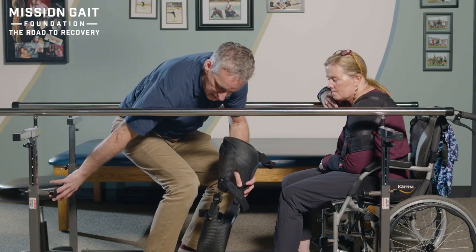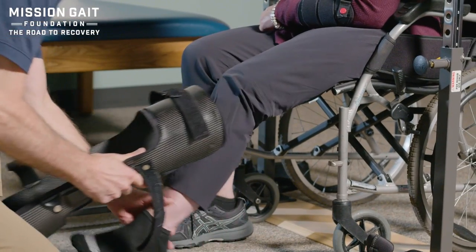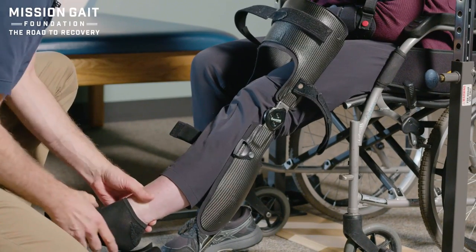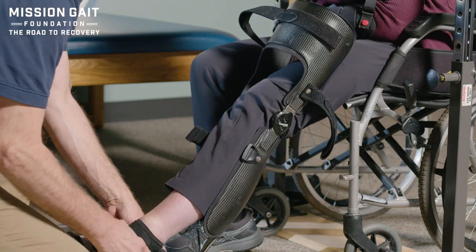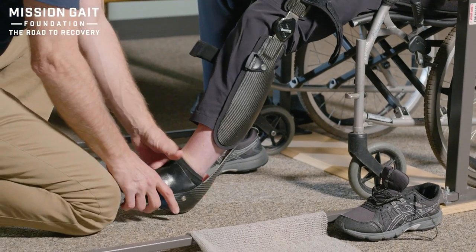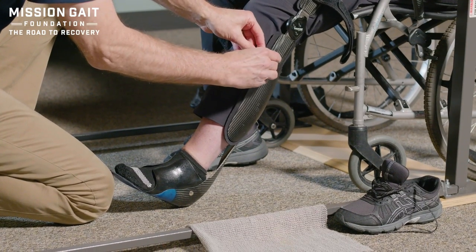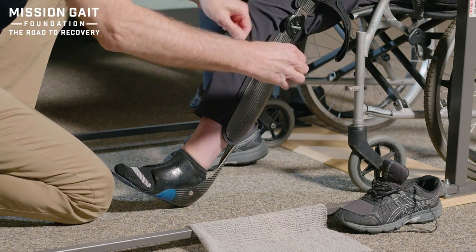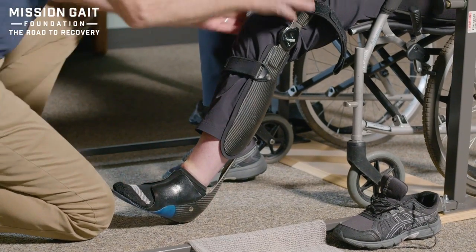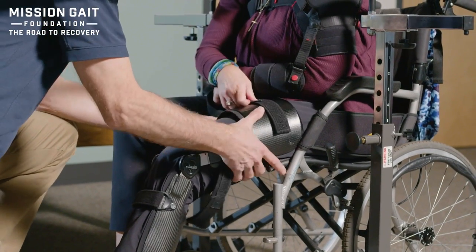First things first in this process is getting down here where we have the patient basically step through the brace. I'm putting it right into position where she's stepped through the brace, pulling back these little boot items until we get the ankle to slide back into place. If I've got that in a good position, I can stabilize that AFO — ankle foot orthoses — component into place, and I know we've got her fairly well locked in. From there, I'm going to bring down this top component.